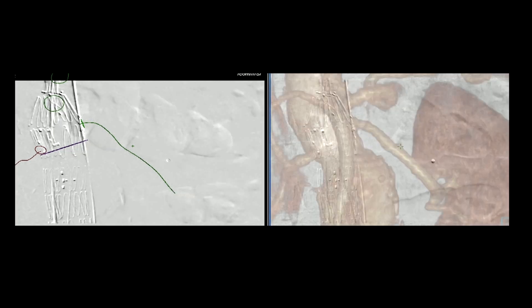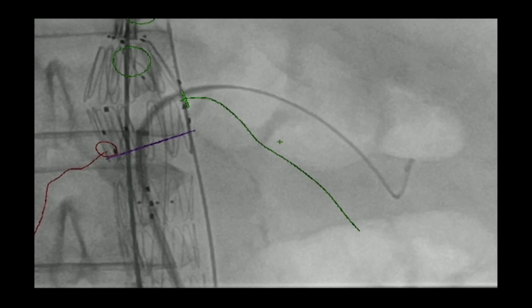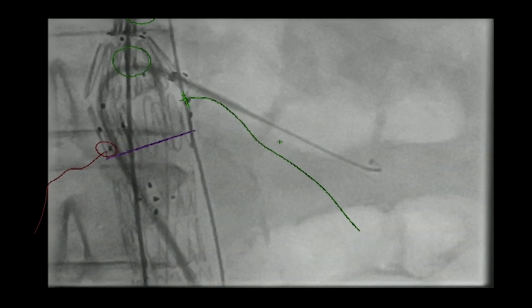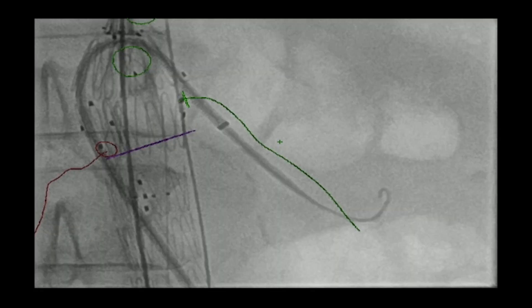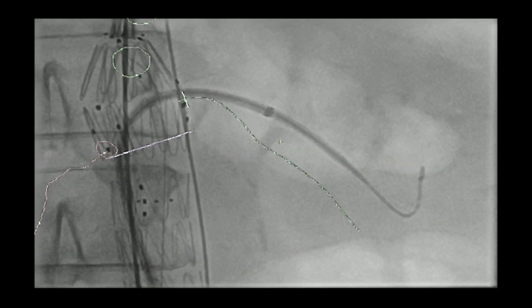The Rosen wire is now in place. You often have to pull the wire down to give the sheath a more favorable angle. We confirm through the quick cross that we're inside the renal artery before replacing the Rosen wire and advancing the sheath into position. The sheath is hanging up just a little bit. We did inspiration-expiration, which didn't make much difference. So it's a matter of using the apex of the enclosed fen to advance the sheath down into the left renal artery, then pulling the entire delivery system down into place.